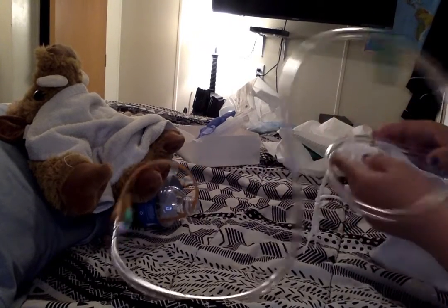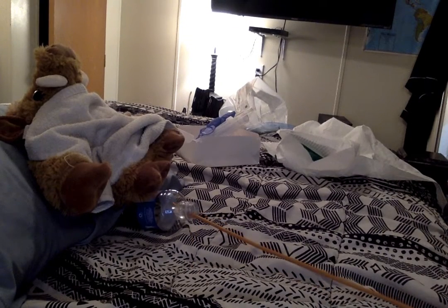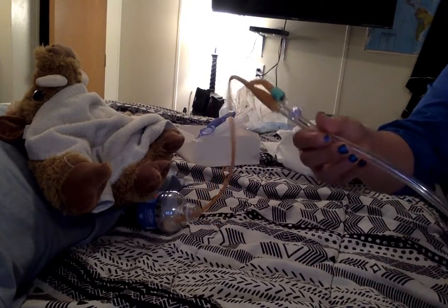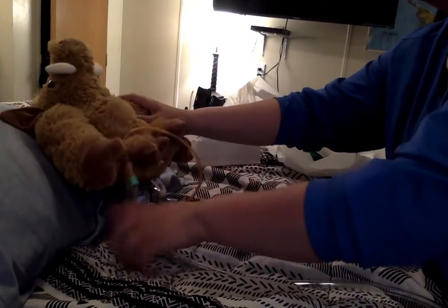We're going to take the bag. We are going to make sure that it is hanging on the bed. We're going to make sure that the urine is flowing and not obstructed. We're going to make sure that there's no kinks in our catheter.